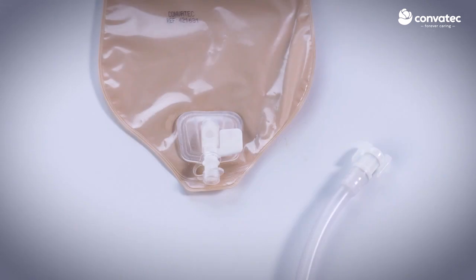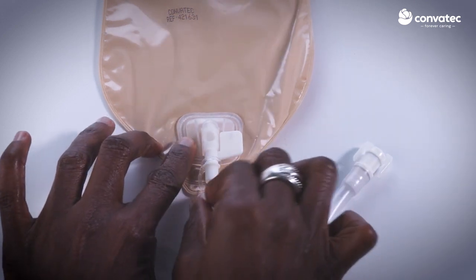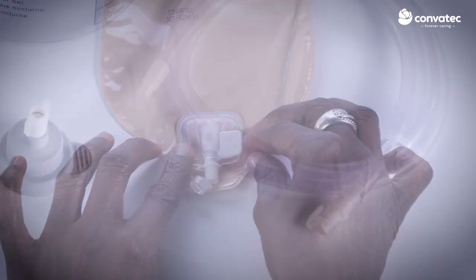To connect the system to your urostomy pouch, start by removing the plug from the bottom of the drain tap. The pouch needs to have a small amount of urine in it before connecting it to the Night Drainage Container.